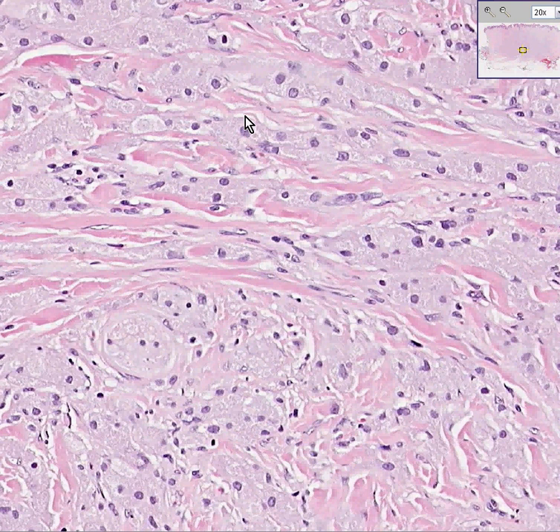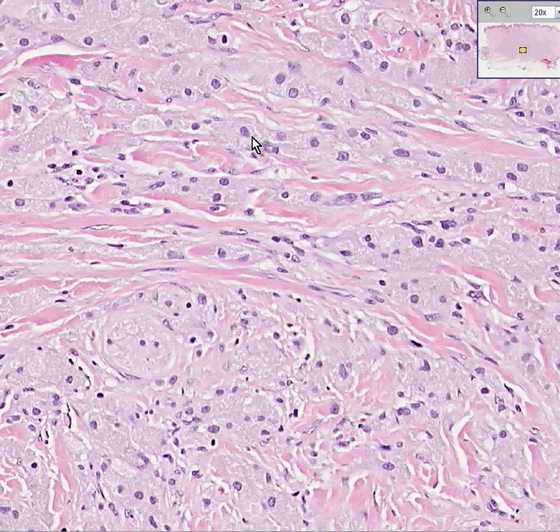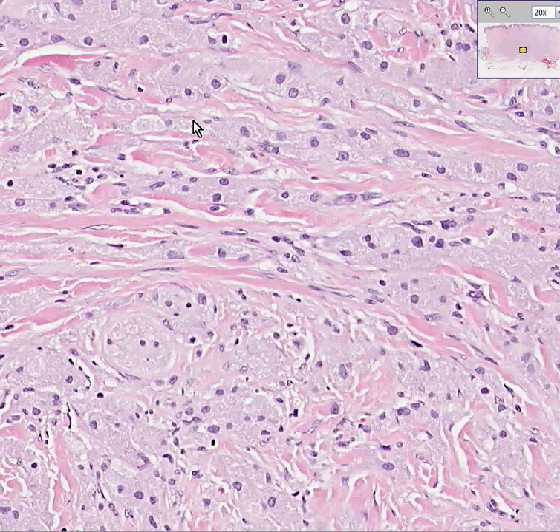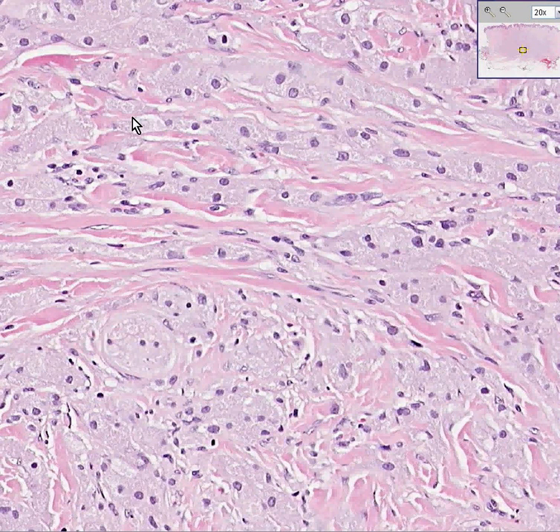They are benign, and they look benign — the nuclei are all uniform, not very big, not very dark, not very atypical in any way. Even though you could appreciate granules within this cytoplasm almost to the point where it looks foamy or fuzzy, the granules don't stain very nicely on regular H&E.